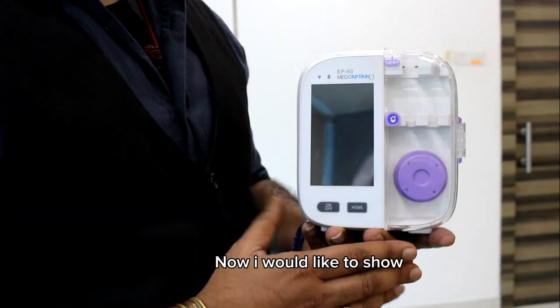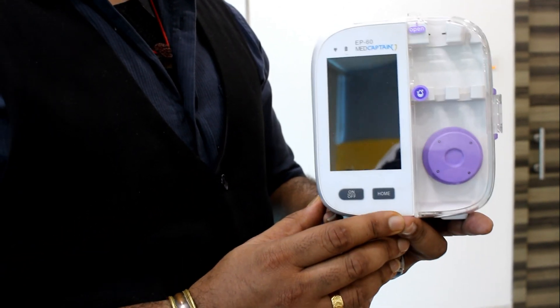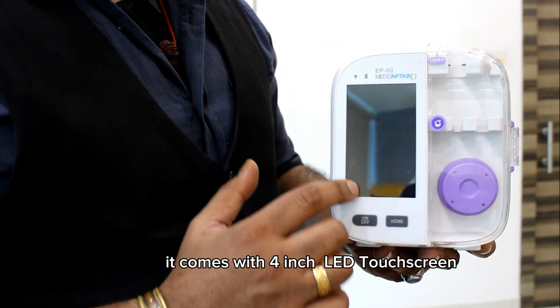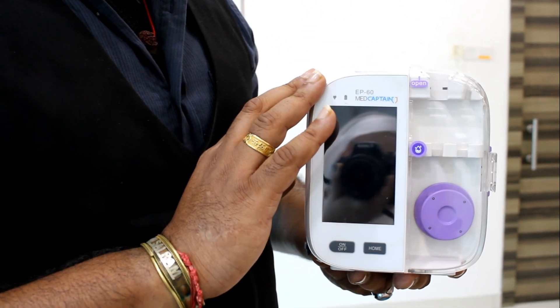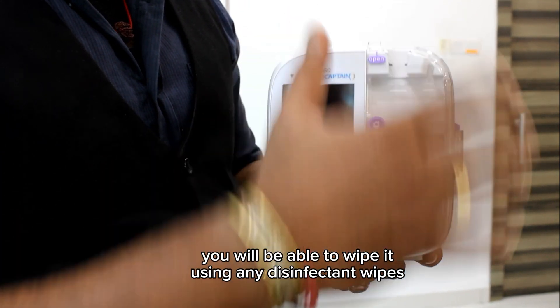Now I would like to show our Medcaptain feeding pump. The weight of the pump is 1.2 kg. It comes with a 4-inch LED touch screen. The casing is a robust casing that is waterproof, and you are able to wipe it using any disinfectant wipes.